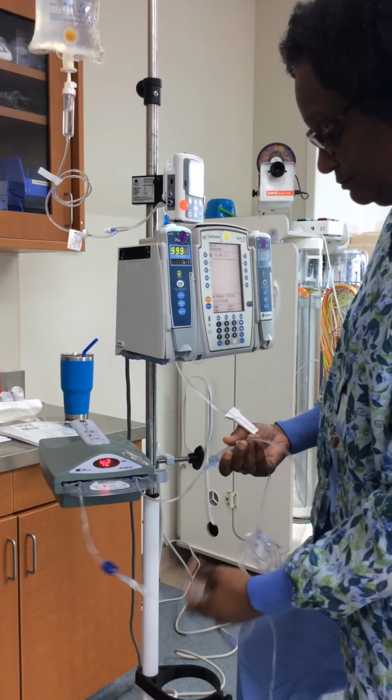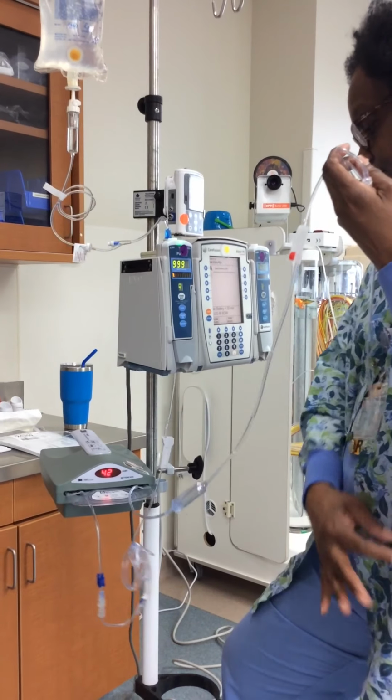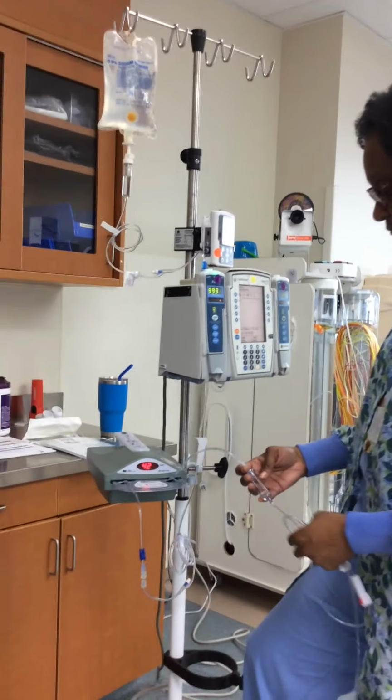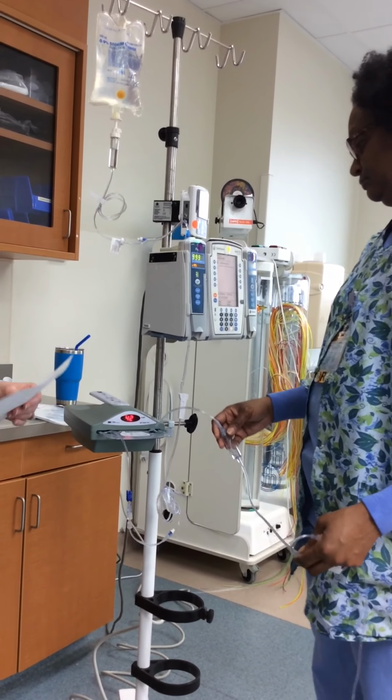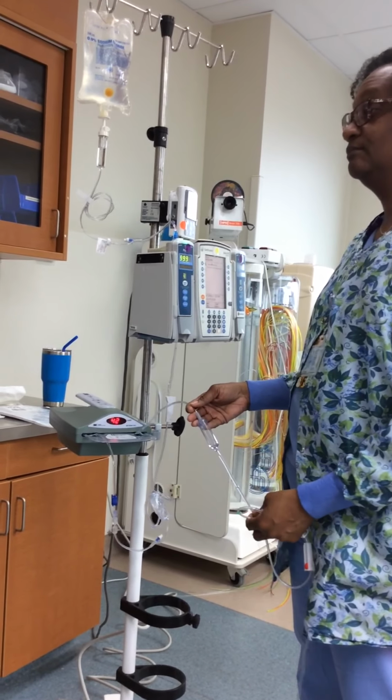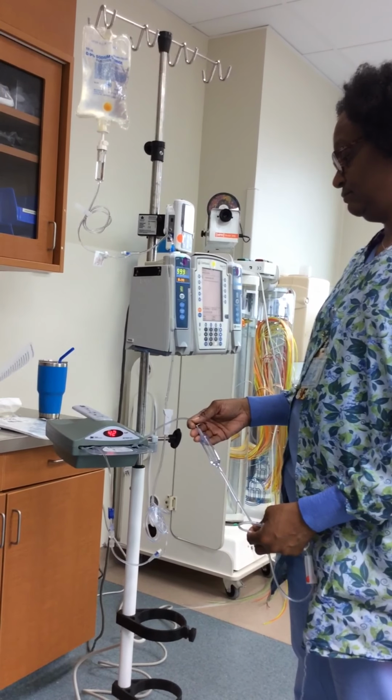So you're going to have to stand here patiently for a few minutes. When we were doing a run through on this, we realized that maybe it's going to be best served to start priming your cassette and getting everything ready before the patient arrives on the unit. So if you know in report that they need warmed fluids, go ahead and get your cassette primed and ready to go for the patient.